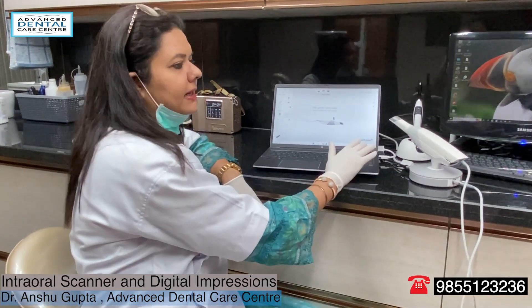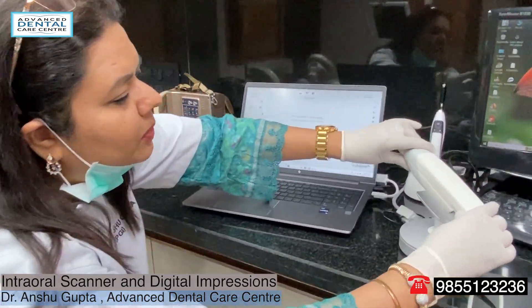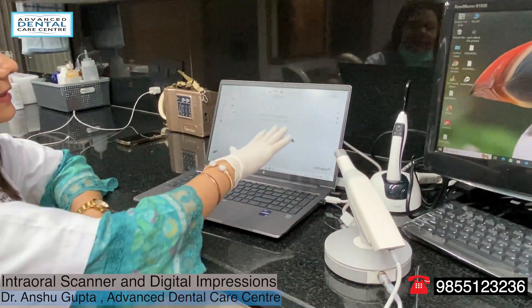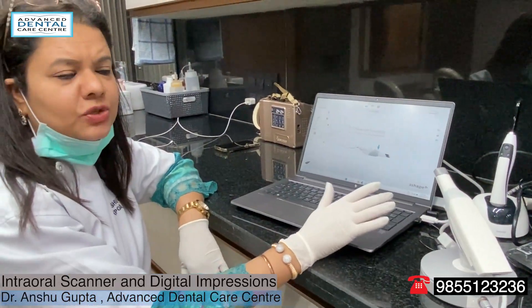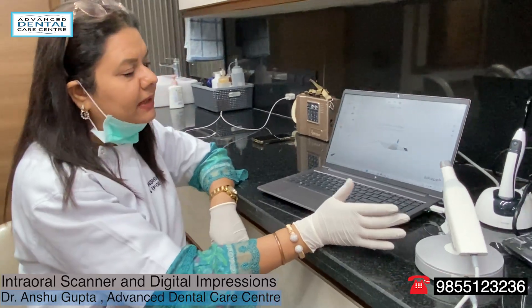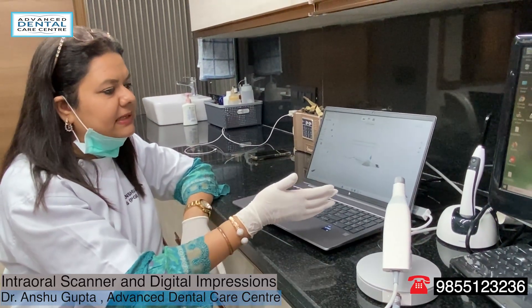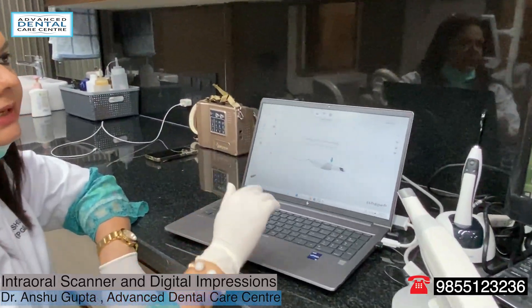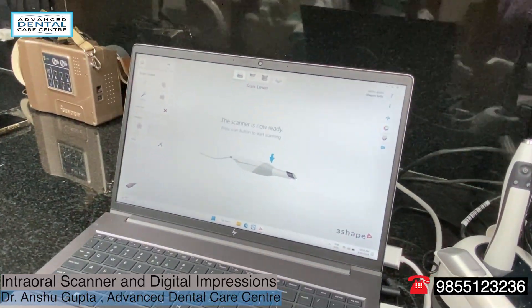This is an intraoral scanner from 3Shape and the model is Trios 3. This is the scanner, this is the handpiece, and this is the computer. I will show you how the impression is made and how you can see accurately and precisely the 3D image of the patient's teeth and mouth instantly, and the same can then be sent to the lab within a few seconds.